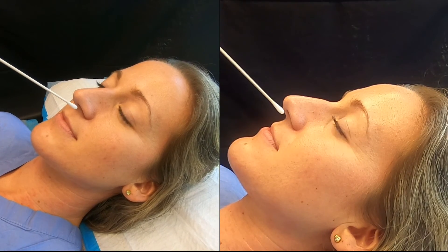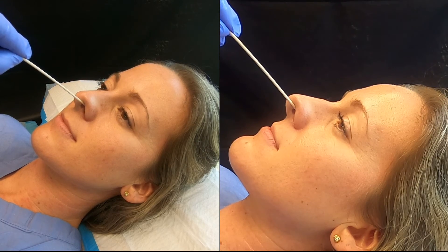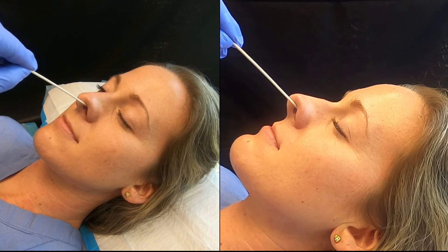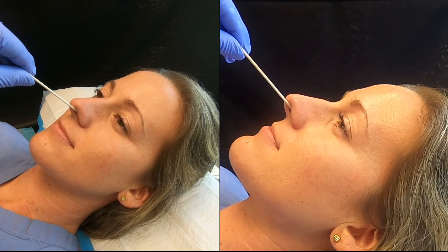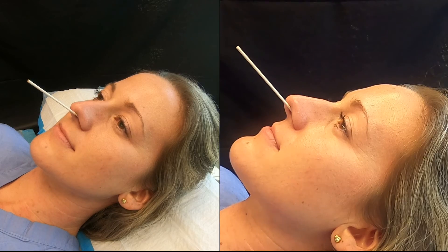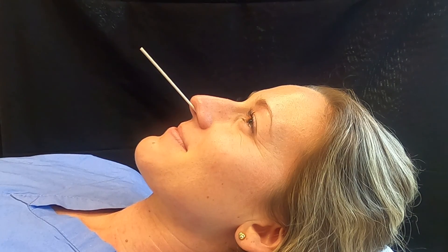The tip of the applicator should now be in contact with the nasopharyngeal mucosa, posterior to the middle nasal turbinate and anterior to the sphenopalatine ganglion. The cotton-tipped applicator is left in this position for five to ten minutes. The entire process is then repeated using the opposite naris. The patient should start to feel symptom relief within 15 minutes.